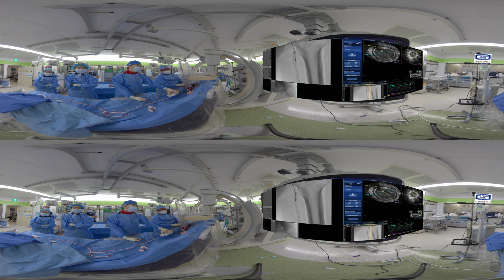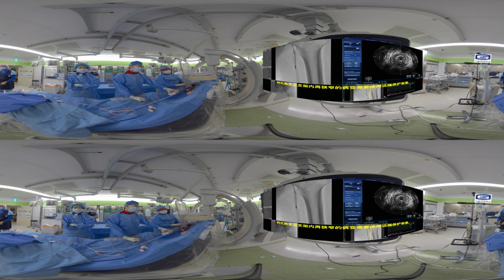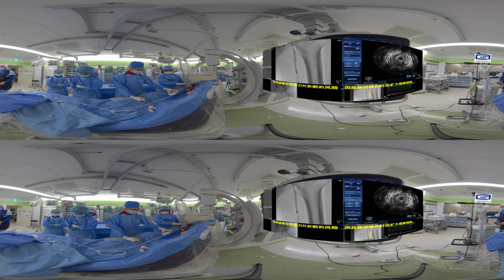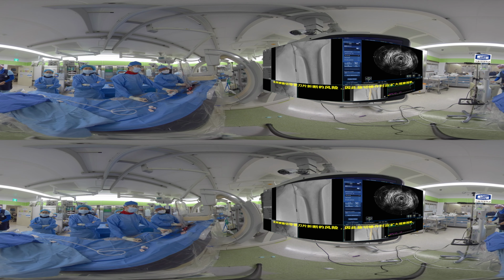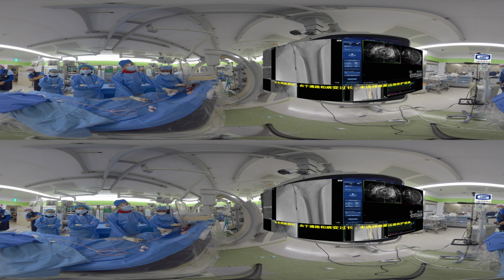The JETstream catheter needs to be advanced slowly, 1 millimeter per second. A distal filter is usually required for calcific lesions and ISR lesions. A stent can be fractured by the atherectomy blade and should be checked with a large view during atherectomy. In this case, a filter was not placed due to long access and long lesions.